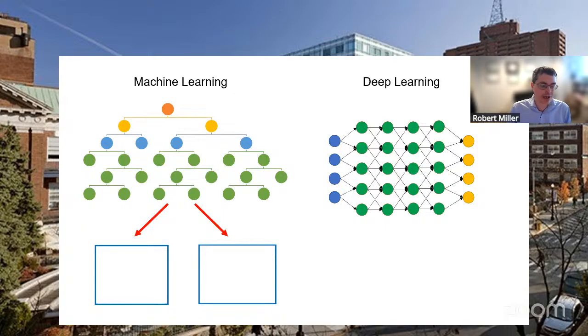For machine learning, a lot of it boils down to a tree-based algorithm. So this is a lot like where you go and do this online test and you answer a series of questions and then it tells you your favorite movie. The difference is here, instead of a series of questions, it's a series of factors, and then it tells you, do you have coronary disease or not?